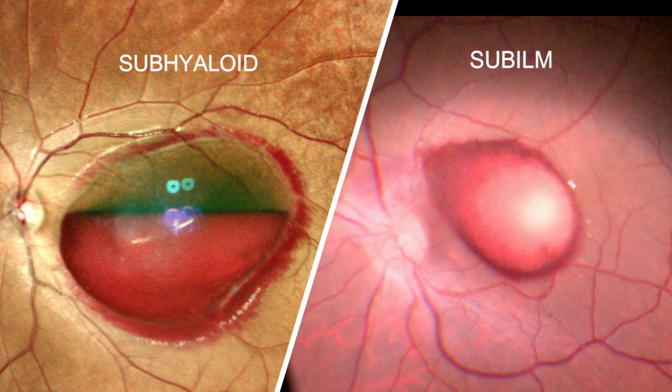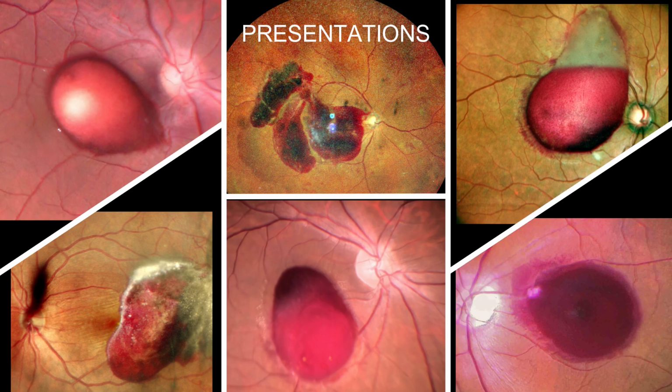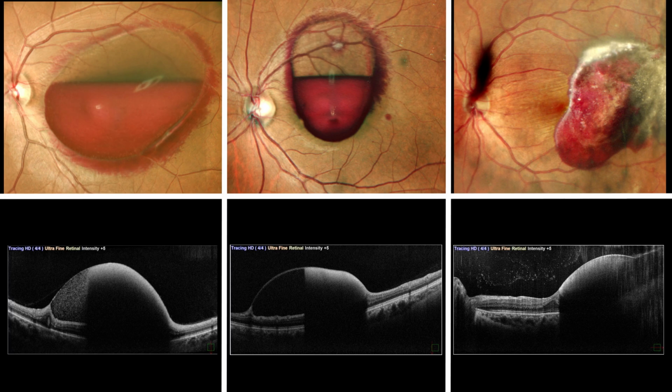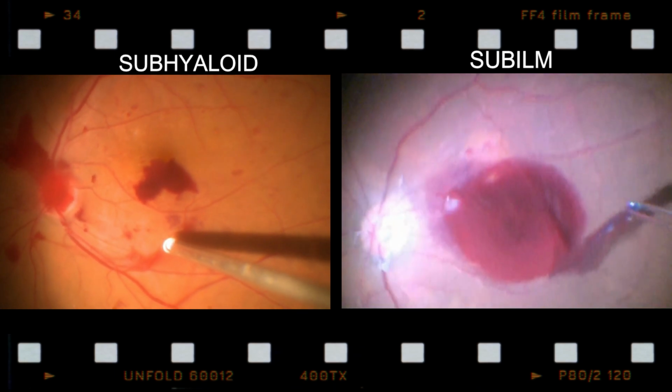Pre-retinal hemorrhages could be located in either a subhyaloid or a sub-ILM plane. Common causes include Valsalva retinopathy, retinal microaneurysms, and proliferative diabetic retinopathy. In this video, we would take you through a variety of intraoperative situations in relation to managing these hemorrhages.